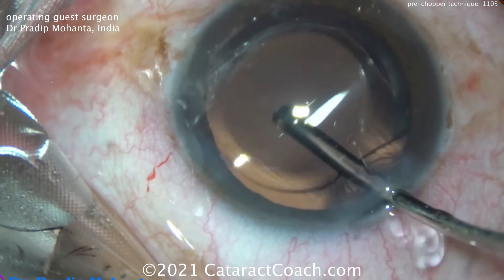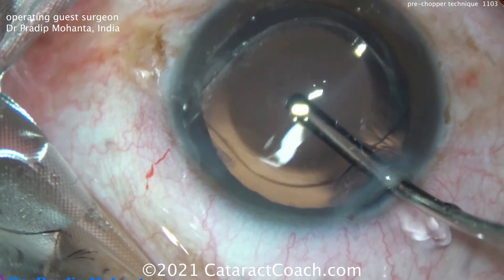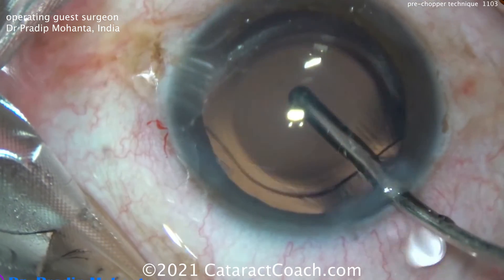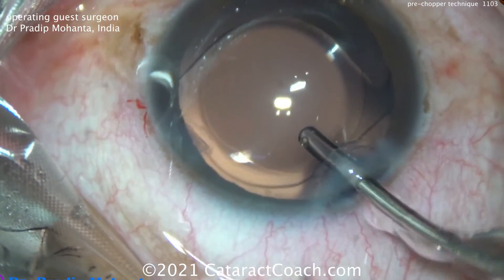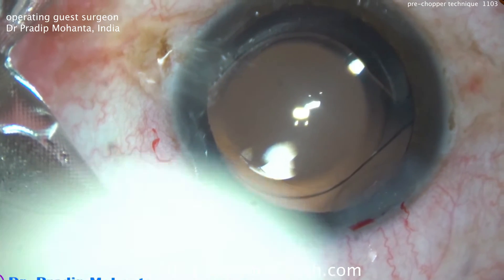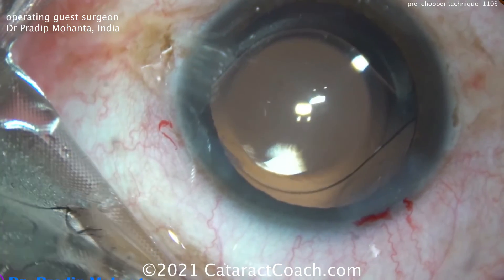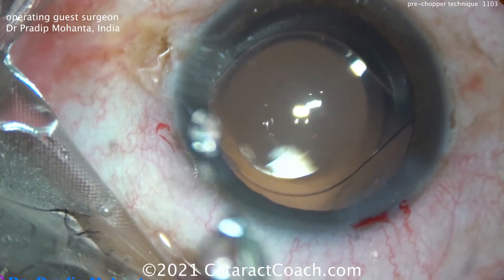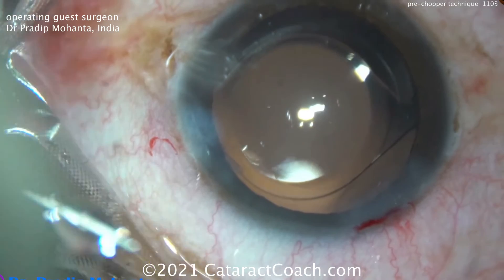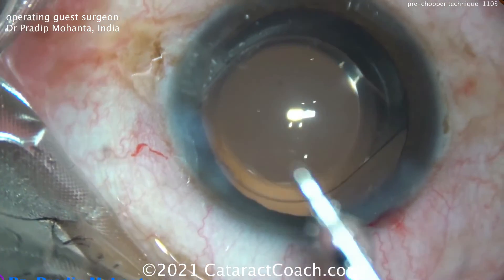Remember, if you're doing a divide-and-conquer technique, it's time to graduate to stop and chop. And if you're at the stop-and-chop stage, it's time to graduate to Faco Chop — traditional, horizontal, vertical, or combo chop as shown here. Or learn to use one of these mechanical devices to split your nucleus and make your surgery far more efficient. Most of the Faco energy you put in the eye should be used to remove quadrants, not to create them. The problem with divide and conquer is you're using most of that Faco energy just to create the quadrants.